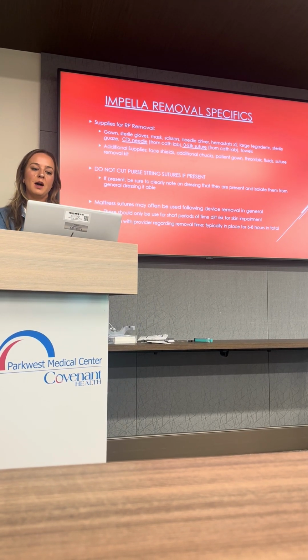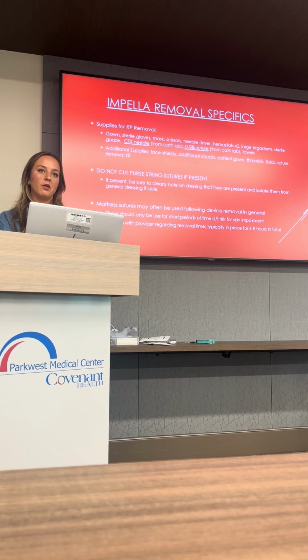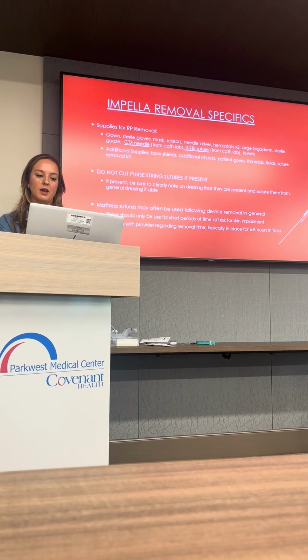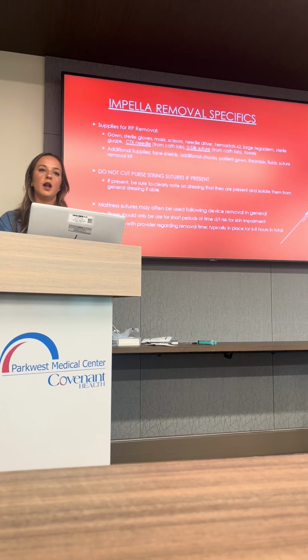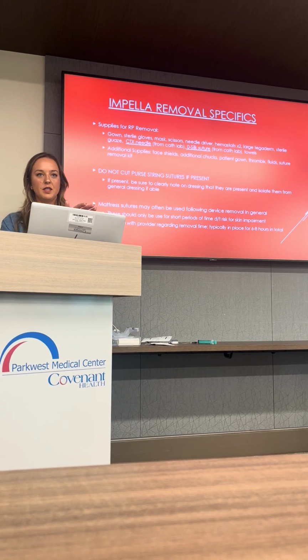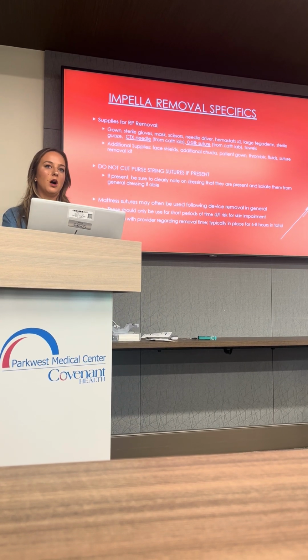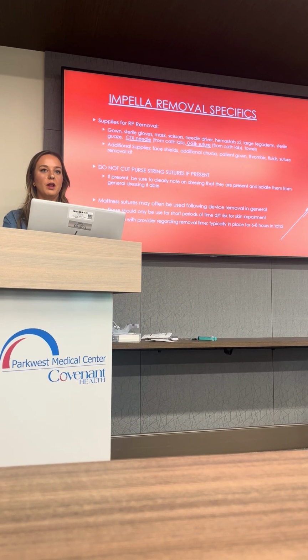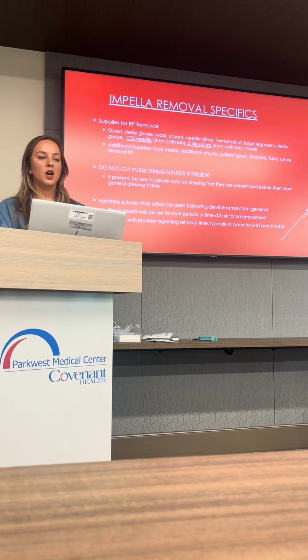But it's a type of suture that's used to help obtain hemostasis after we remove some of these larger devices. The big thing to take away from it is that you don't cut it, you shouldn't touch it. It's a provider specific use, and so you just need to protect it at all costs. Make sure that whenever you have those in place, you're communicating that. Make sure that it's documented everywhere.